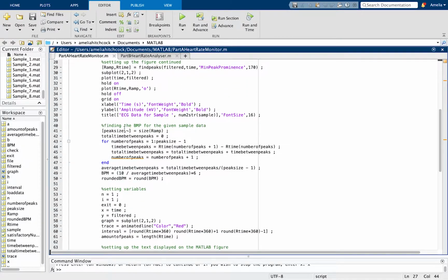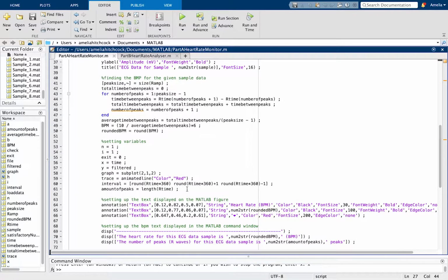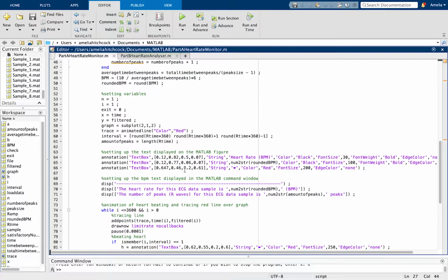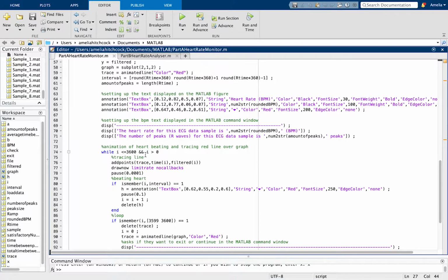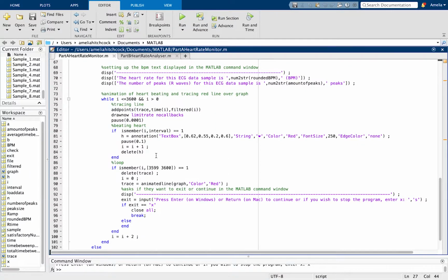It then finds the BPM by finding the average distance between the peaks and then divides that by 10, and that finds you the BPM. Then I set up more variables. I then set up the text displayed in the MatLab figure, and I set up the text displayed in the MatLab window. This is the code for the heart beating and for the red line tracing the graph.